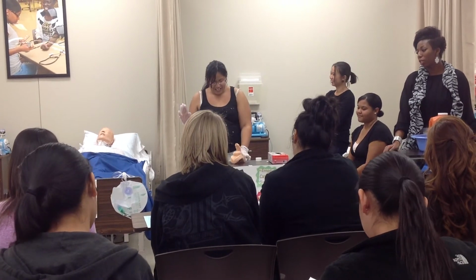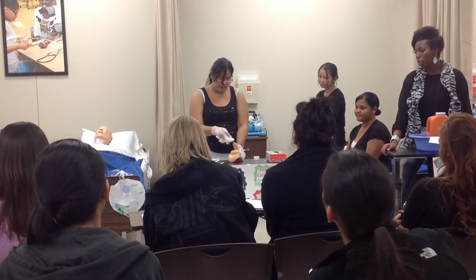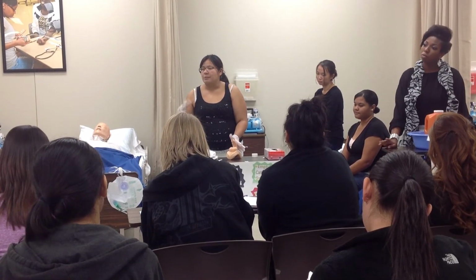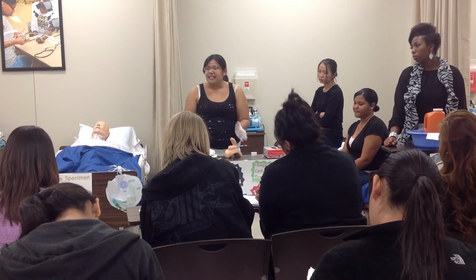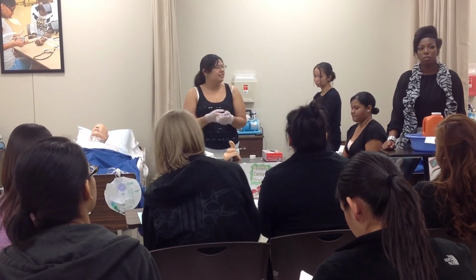So you're gonna go ahead and remove it, just gently roll it off. Once you're done, you're gonna dispose of that properly. You're gonna provide peri-care, the way we learned it, and you're gonna be looking at the skin for any skin irritation or anything, and you would be documenting that if you needed to. And then you would replace it again, continuously every 8 hours until you do not need it anymore.